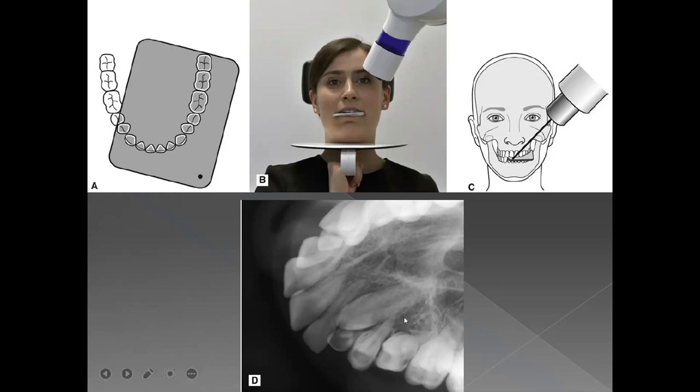And this obviously has to be done separately for both sides. So in this patient, as you can see, they're doing it for the left side. Here you can see an impacted tooth over here. You can also see the D and E over here. So these can help you somewhat in locating any pathology in the maxillary posterior teeth.